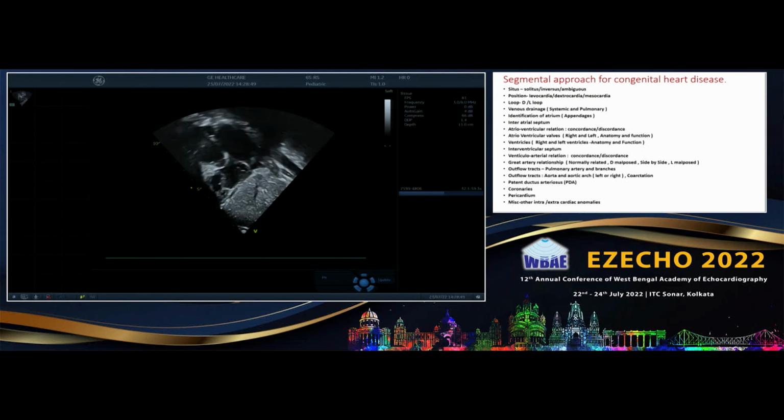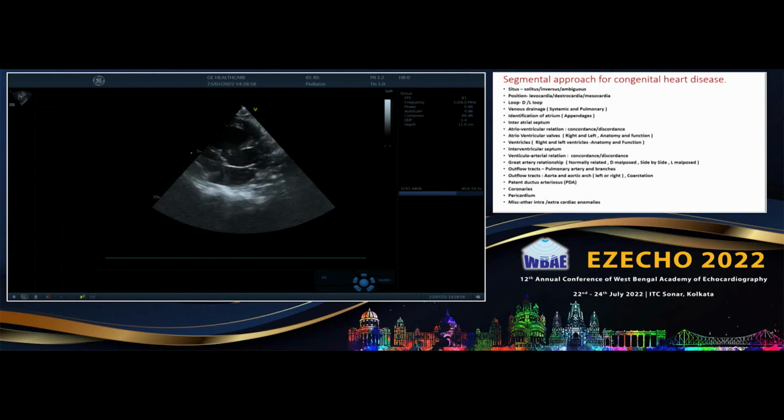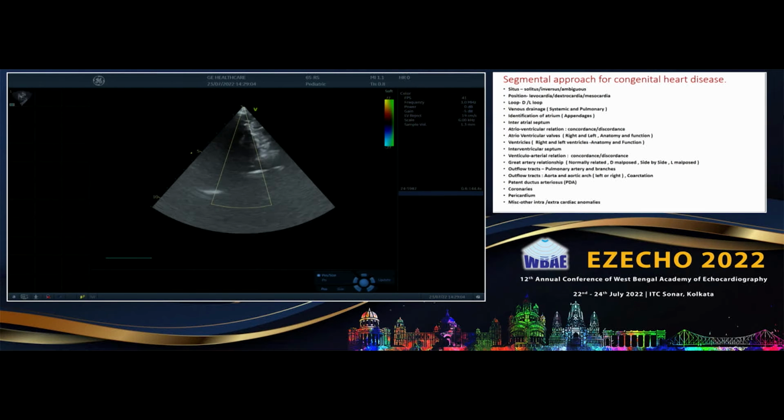So if you can jump and come to the... So again, in these types of situations, you are forced to give some opinion. You will have to quickly see the important things. The timing adjustment is a little tricky, sir.